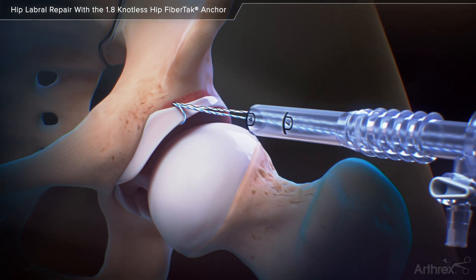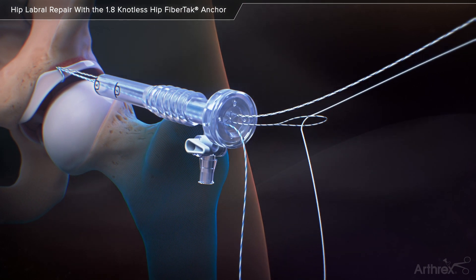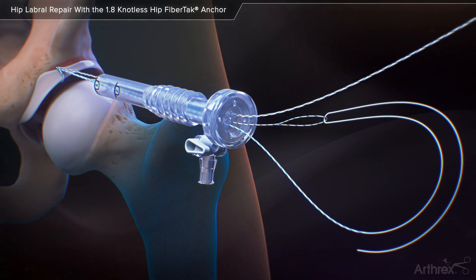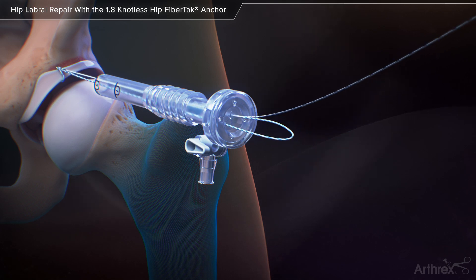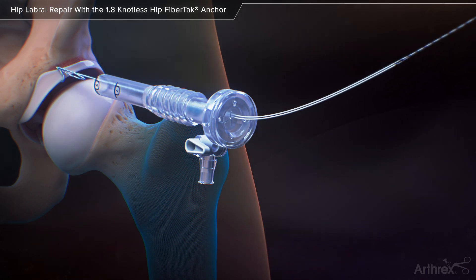Outside of the cannula, pass the white end of the repair suture through the loop of the shuttle suture and pull the non-looped end up the shuttle suture until resistance is felt. Gently pull three to four light tugs to pass the repair suture back through the anchor sheath.